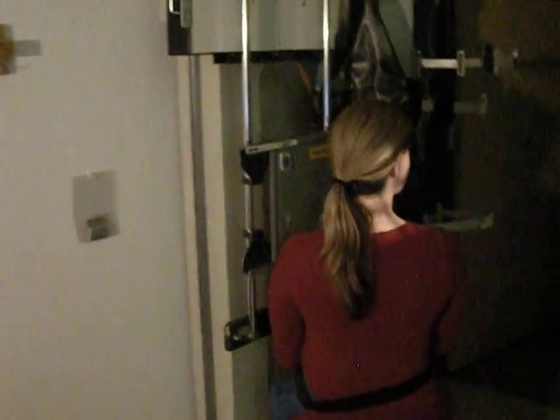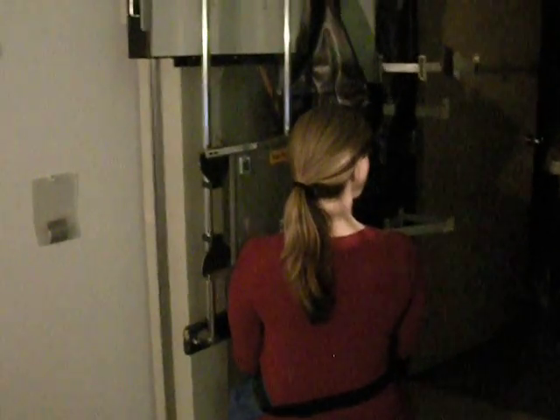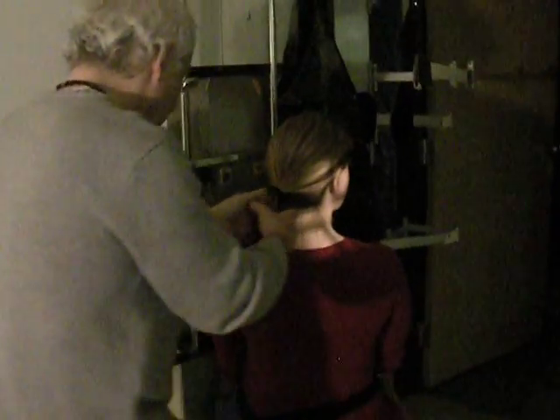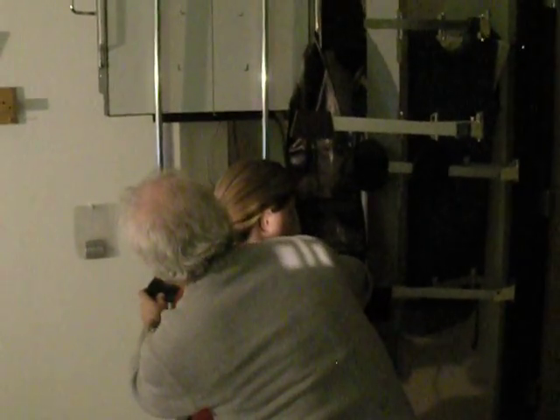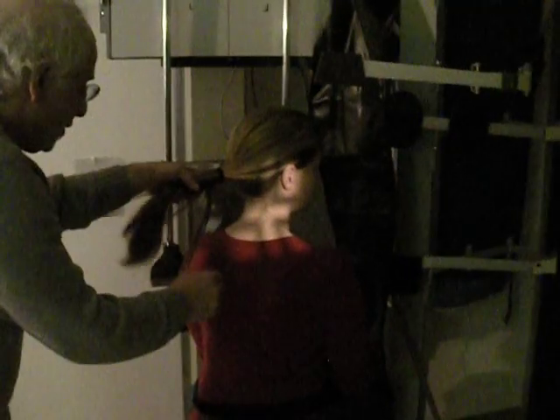And this central ray is to mid-cervical, and it should be slightly above where you hope it will exit because it's being angled down. This is an LAO position, and it's going to demonstrate the left cervical IVFs. Now the film and the ray are centered to one another.